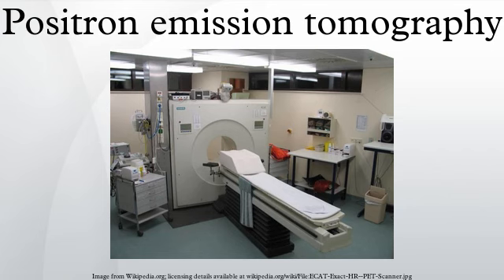Localization of the positron annihilation event. The most significant fraction of electron-positron annihilations results in two 511 keV gamma photons being emitted at almost 180 degrees to each other. Hence, it is possible to localize their source along a straight line of coincidence, also called the line of response or LOR. In practice, the LOR has a non-zero width as the emitted photons are not exactly 180 degrees apart.